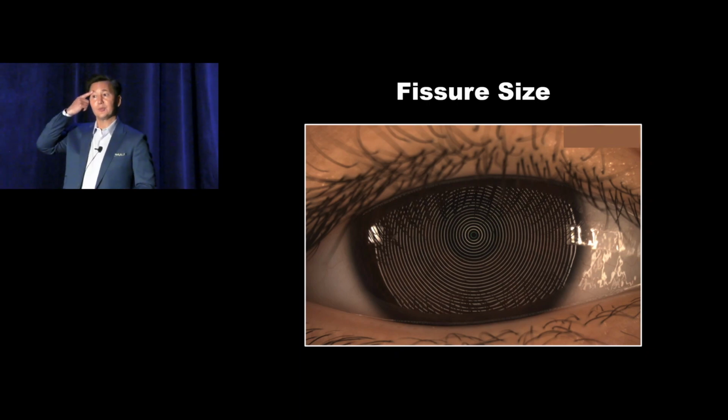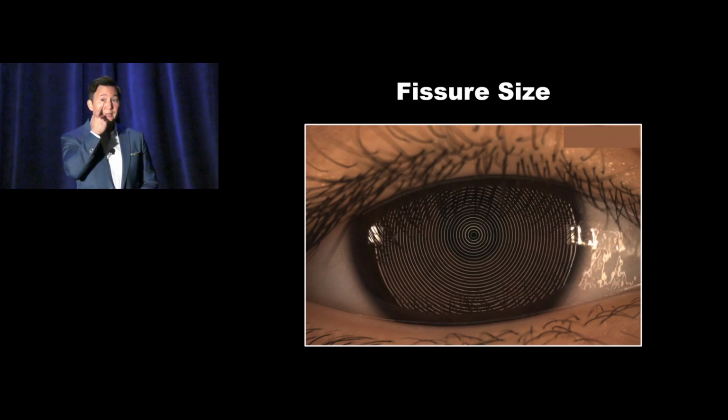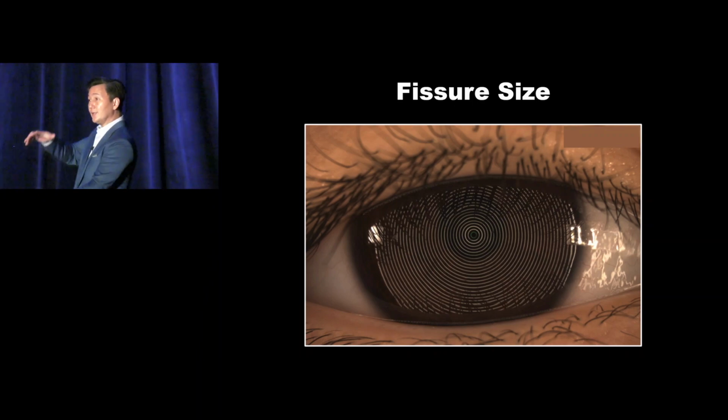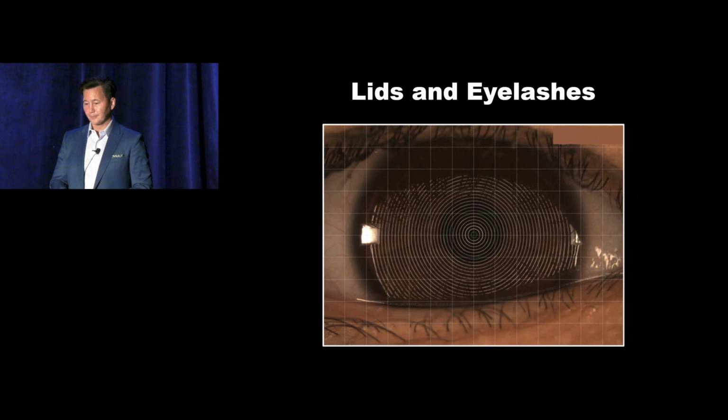As an example, just pulling up on the eyebrow, if your topographer is right in on the orb, just reach up and pull up on some skin, and that'll get a little more information. You can have the patient pull down on their cheek, just a hair, to move it out of the way. You don't have to have them drag it down, but anything to open up the fissure and get more information is our goal.